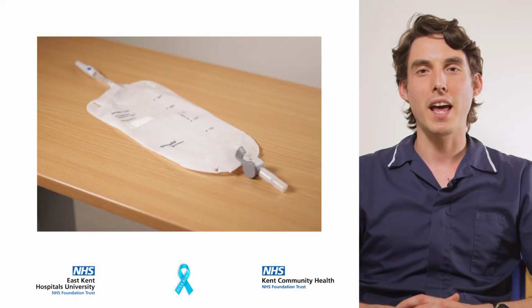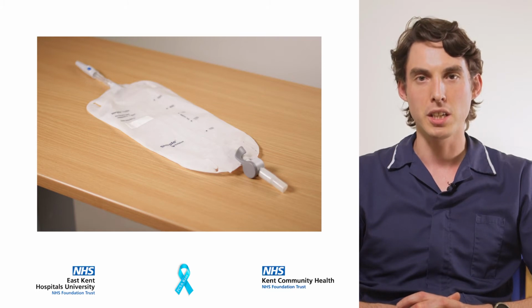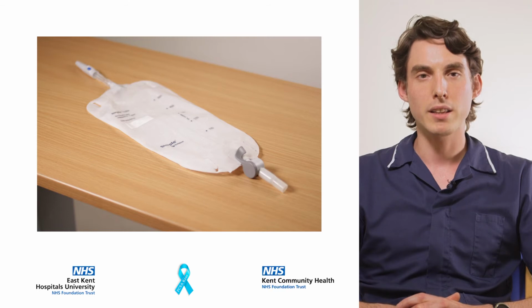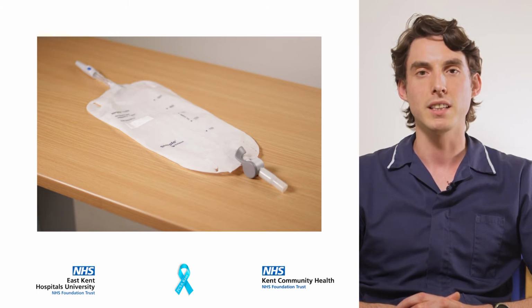Care of urethral catheters involves routine daily personal care to maintain meatal hygiene. Soap and water is all that is required. Using a disposable wet and soapy wipe, clean the head of the penis. Make sure to retract the foreskin to clean underneath, unless you're circumcised, and remove smegma, as this can increase risk of infection if left uncleaned.